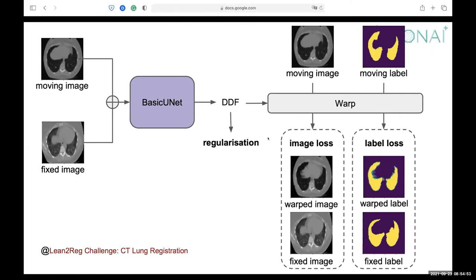For example, in this case we have the label of the lung. We are using the label as auxiliary information to help with the registration task. The task of the tutorial is to predict a DDF — a Dense Displacement Field.